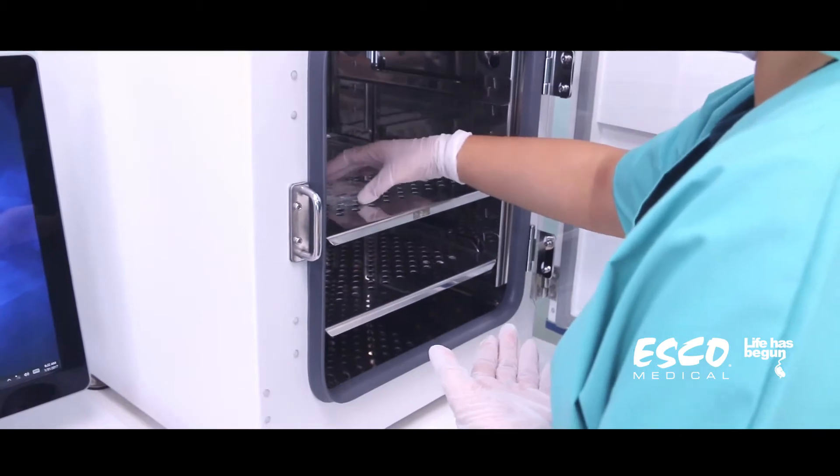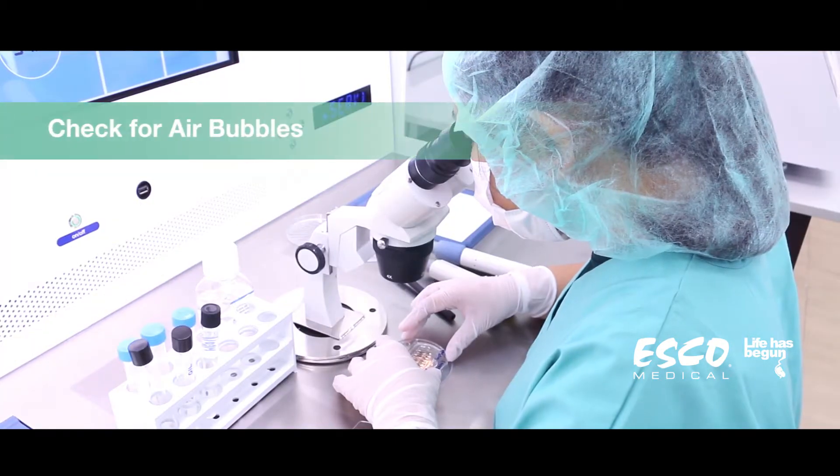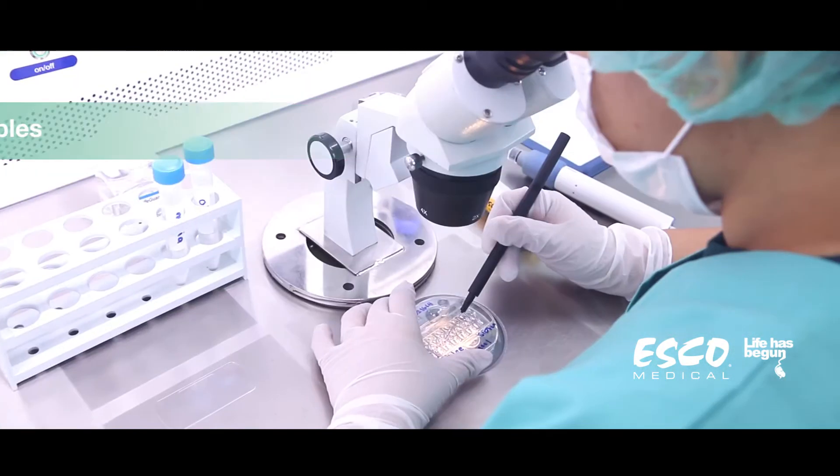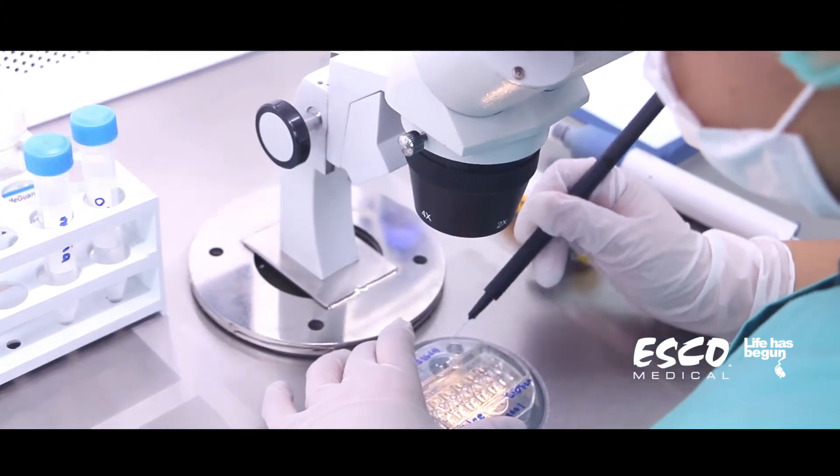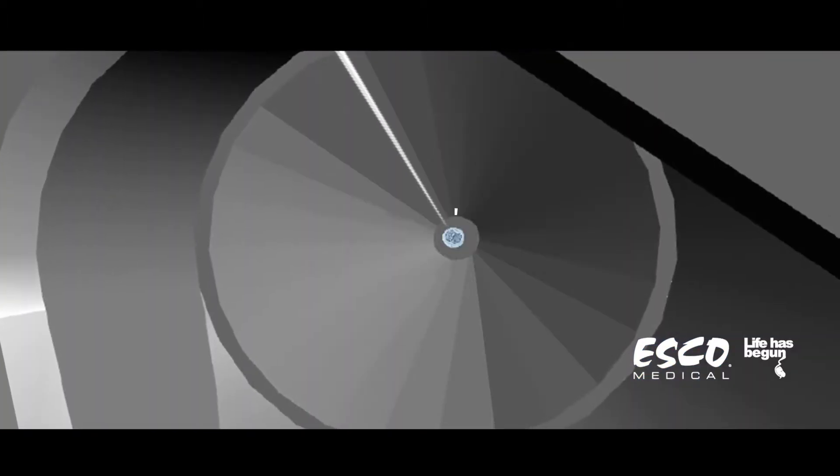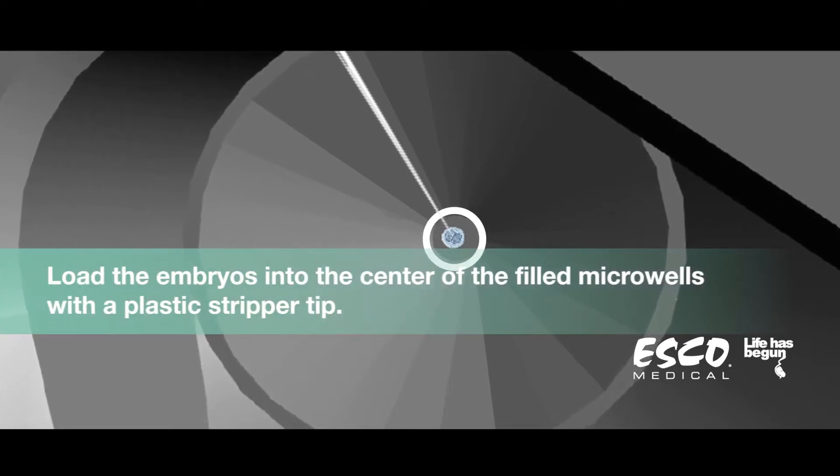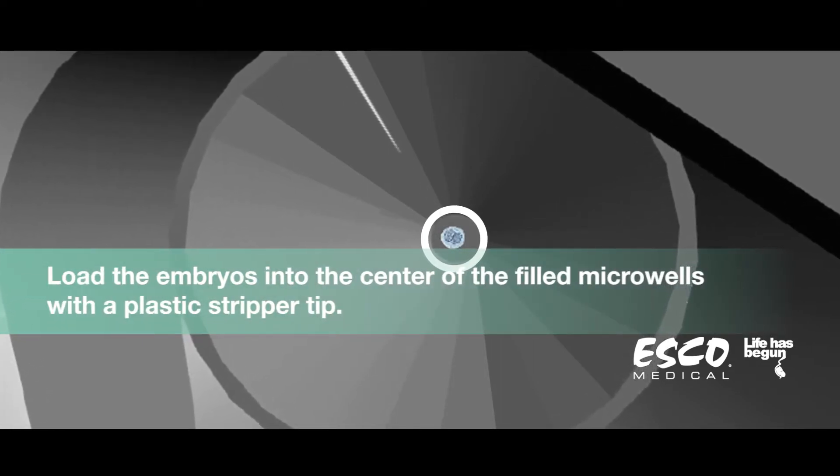Loading of embryos. After equilibration, check for air bubbles in the culture wells. Release any bubbles with the stripper tip and remove with the dispensing pipe tip. Then load the embryos into the center of the filled microwells with the plastic stripper tip.